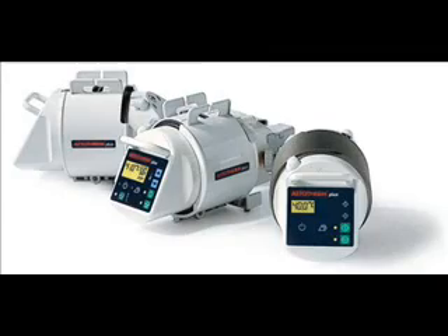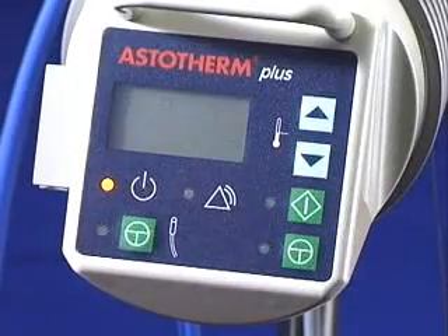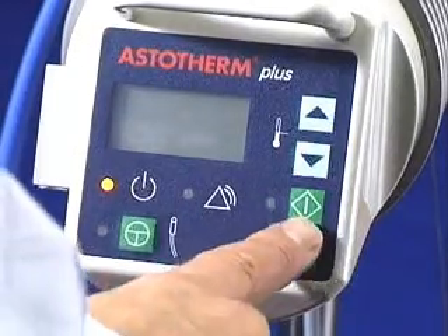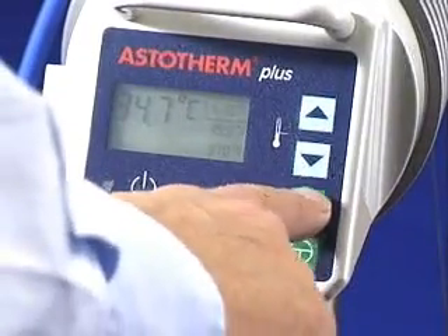It works like this. As soon as you plug the unit in, it goes into standby mode automatically. After switching on, the automatic alarm test is carried out and the heating process is started.